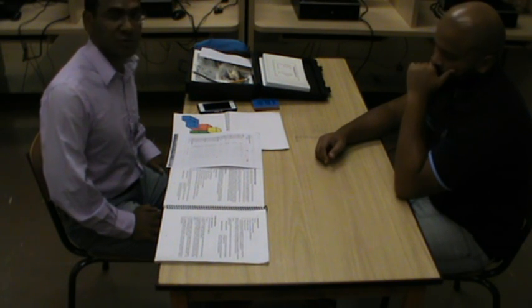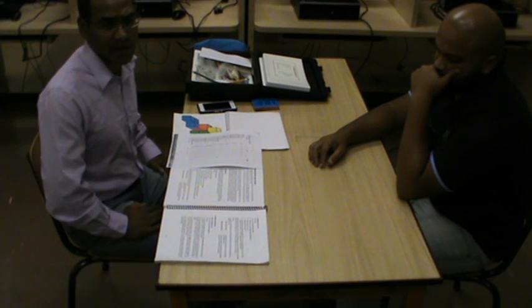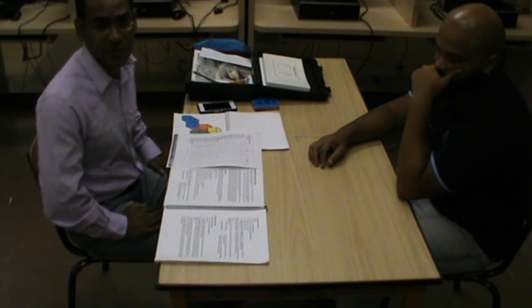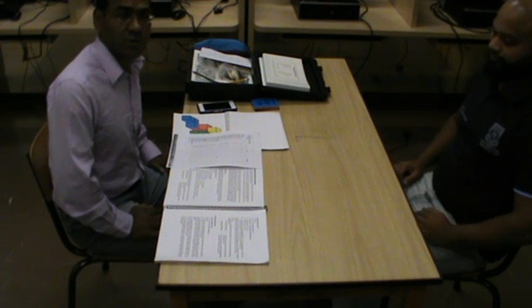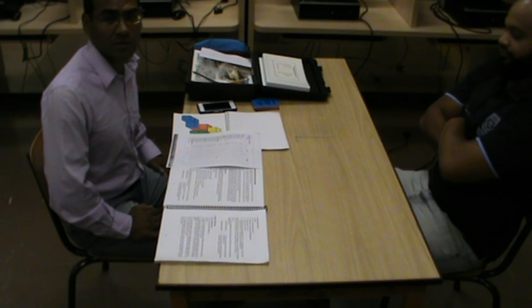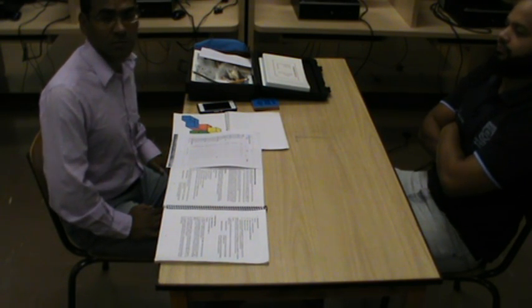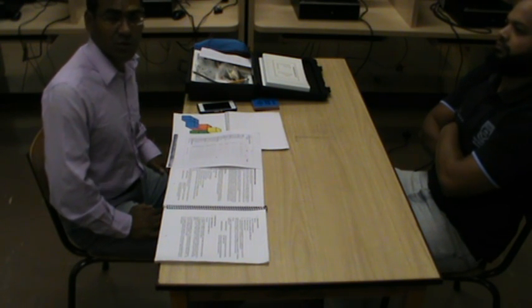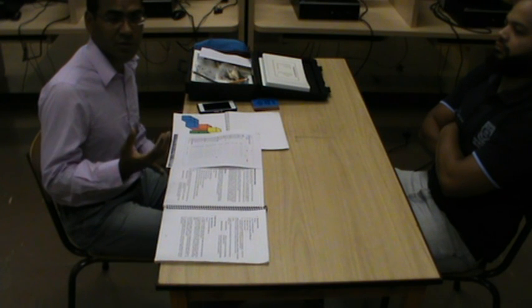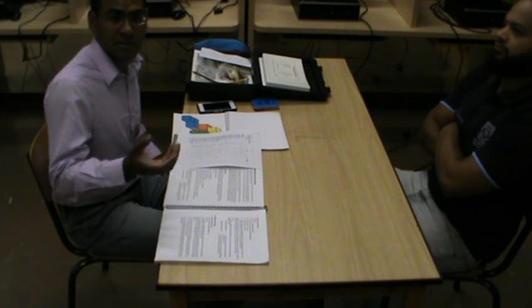The LOTCA test is used to assess a client's cognitive functioning as well as an individual's perceptual functioning in some of the tasks. So if you're an occupational therapist working with clients with stroke or brain injury or pathology that affects brain functioning, you can use it as a measure of how far this client is in treatment.